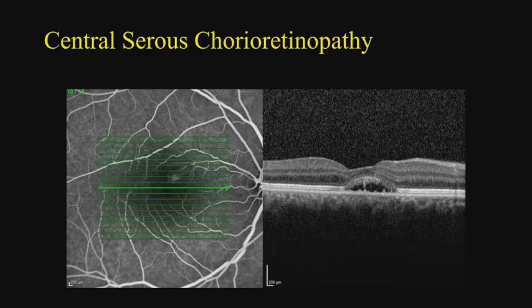Partly because when you have CSC, you're really not sure whether it's that 5 or 10% that will become chronic CSC. And even for those with chronic CSC who fully recover, getting 20/20 vision back or 6/6 vision back, they still say they have a large contrast loss. And when we did some work with reading speed and retinal sensitivity, they were significantly reduced. So again, the same argument: with your eye or my eye, whether I would want to wait a few months before it becomes chronic, or go to someone who knows what they're doing and use micropulse on my eye.